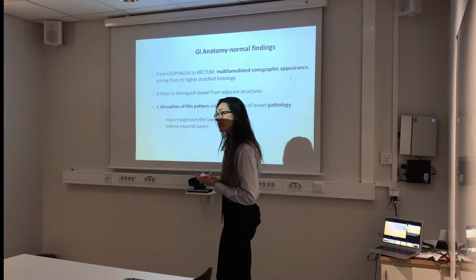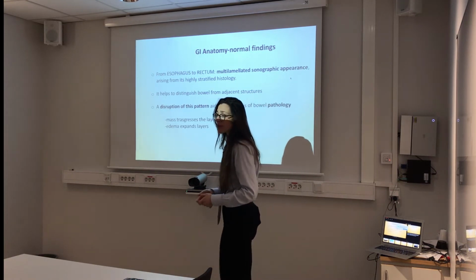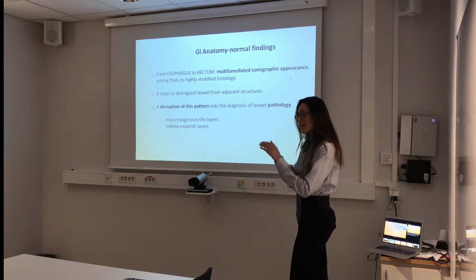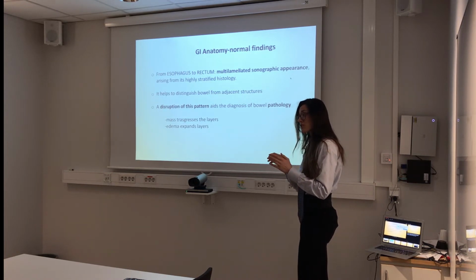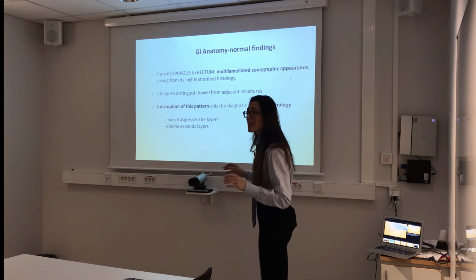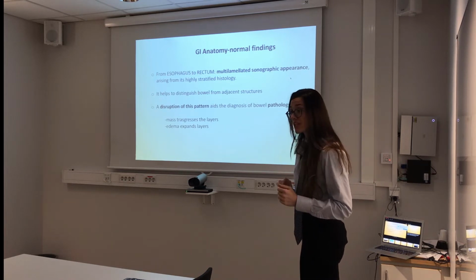If I see the colon, what I see is just air. What I see is the big enemy of ultrasound, which is air. When the belly is full of air, this is not something wrong. It's because there is a transit of feces and air in the bowel, so it's absolutely normal. From the esophagus to the rectum, the gastrointestinal wall is multilamellated, like a circumferential concentric structure, and then we have many layers. The problem is that in the colon, our big bowel, we cannot see them. We just see air. So when you see air, it's normal. When you start to see the colon physically, when you see the thickness of the layers, it's pathological, right?